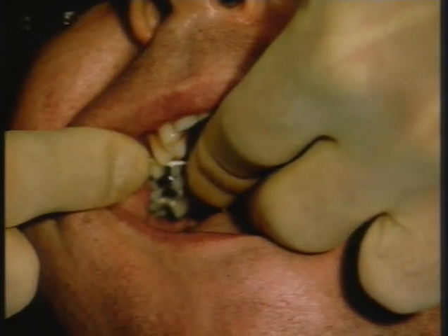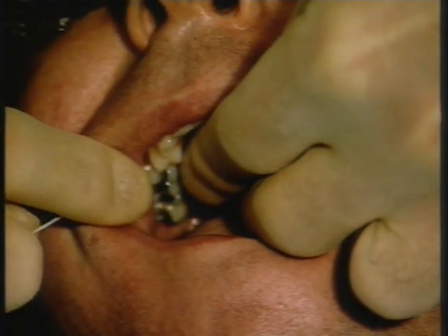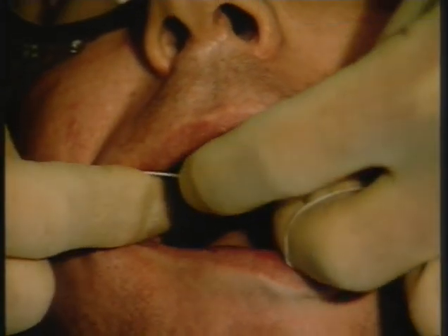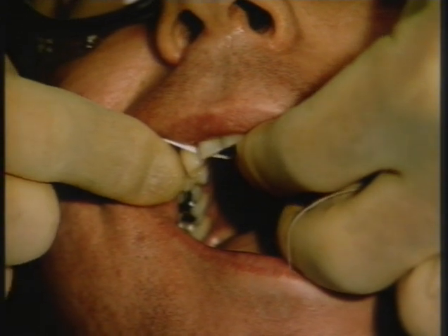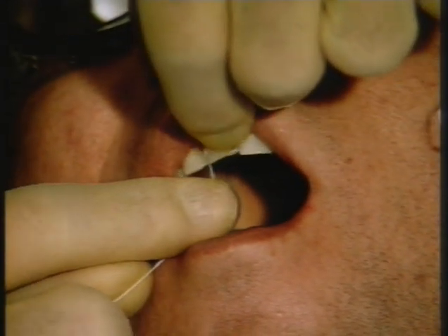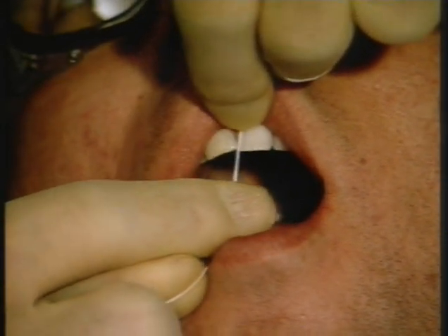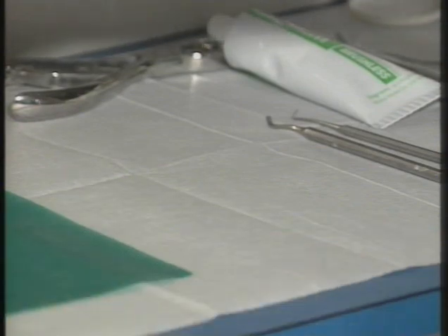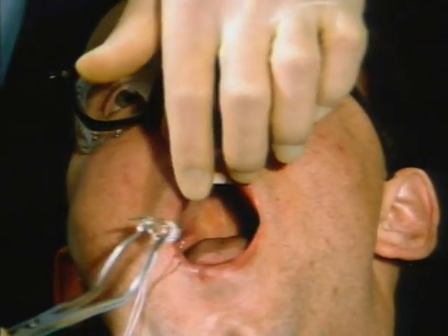Those contacts seem to be of about normal pressure. That's perhaps a little bit tight, that one. That one's very loose. And of course this is critical, being the anterior one. A little bit slack, but fine. Oh, you just come around towards me a little bit.